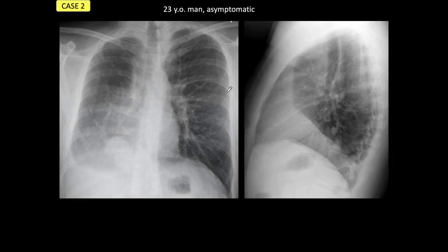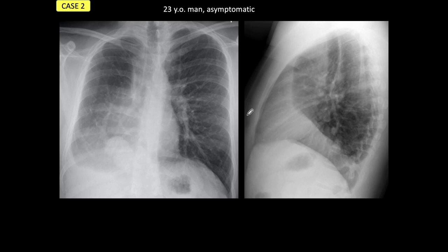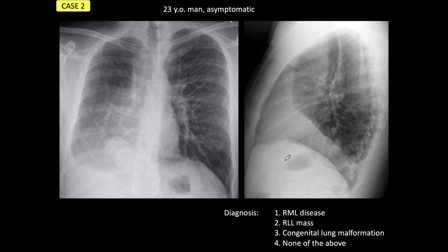Let's go now to case number two. This is a 23-year-old man, asymptomatic. Obviously there is a very striking abnormal appearance of the right hemithorax and right lung, and also on the lateral view there are abnormal opacities. I'm going to give you four possible diagnoses: right middle lobe disease, a right lower lobe mass, a congenital lung malformation, or none of the above.